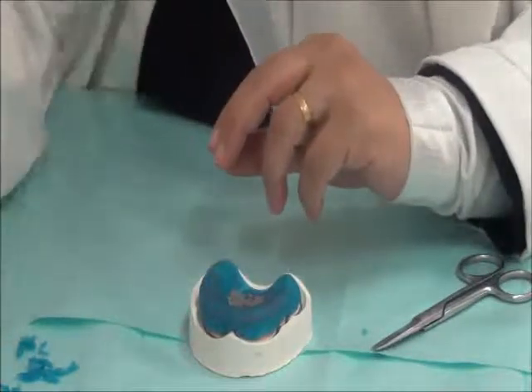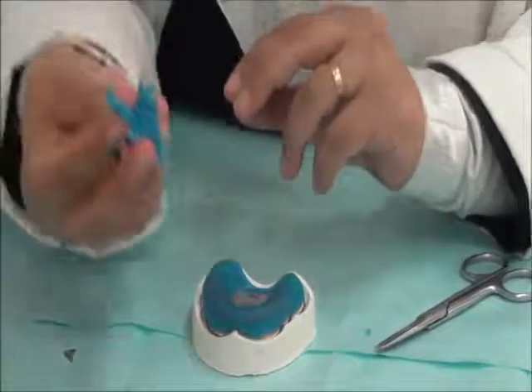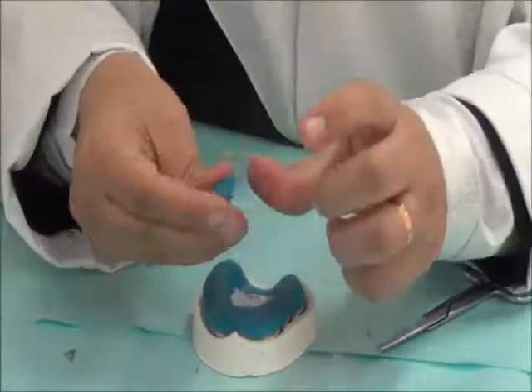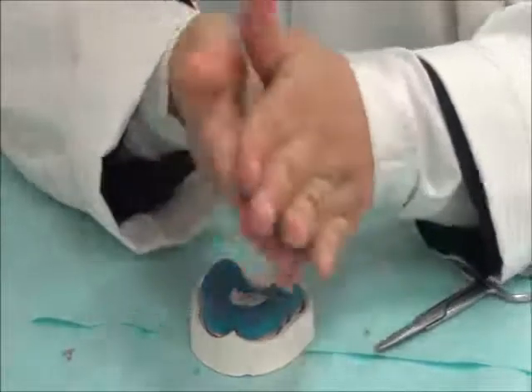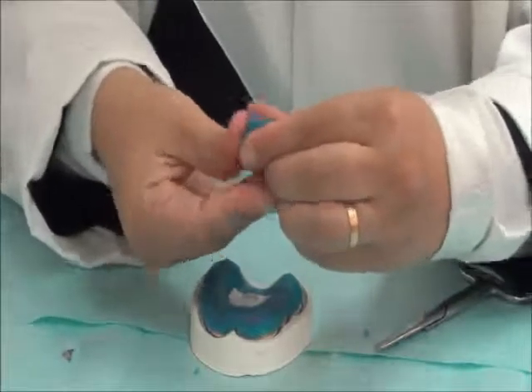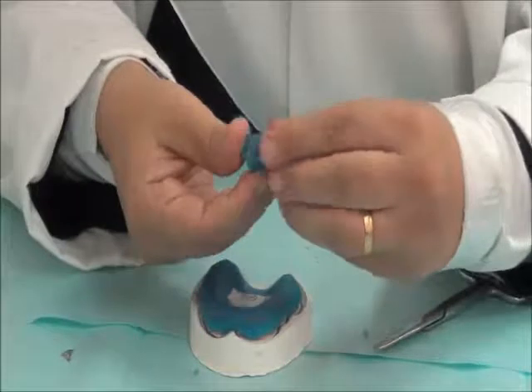For the handle, we can take the excess that we had and mold it into the form of a roll. Okay, we press the excess from one side, so we roll it, and it will have this shape.